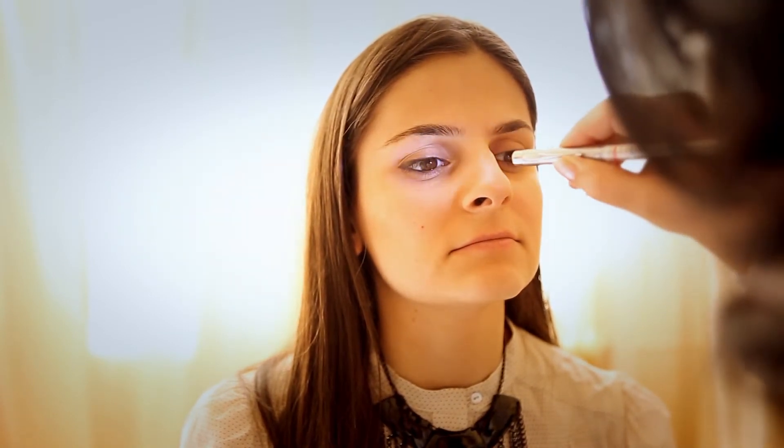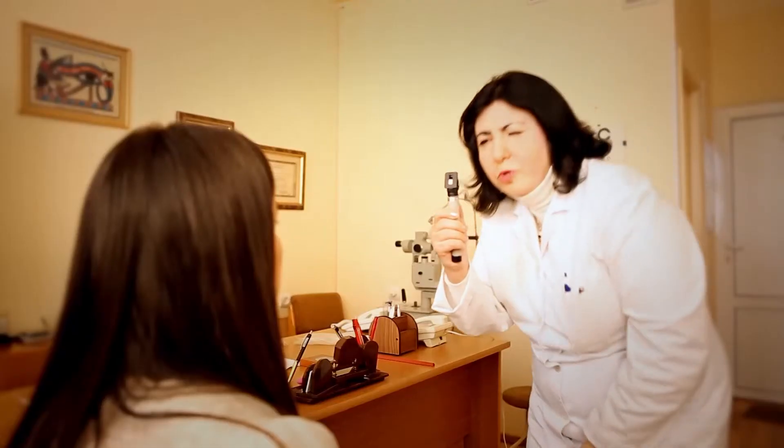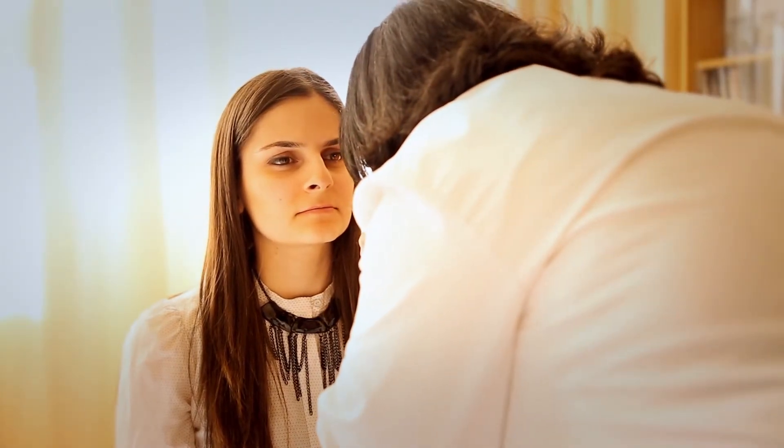Assess the anterior chamber for both depth and clarity. Inspect the cornea and iris. Assess the lens for clarity through direct ophthalmoscopy. Use the ophthalmoscope to study the fundus, including the disc, vessels, and macula.